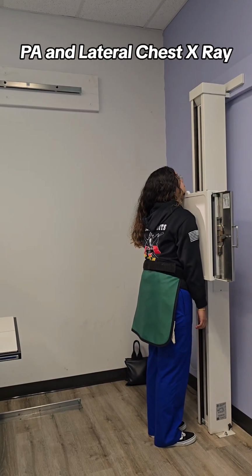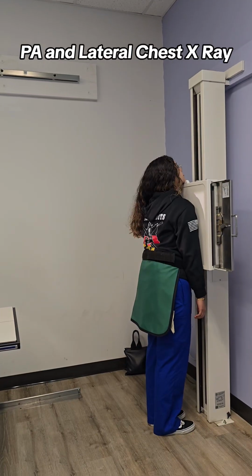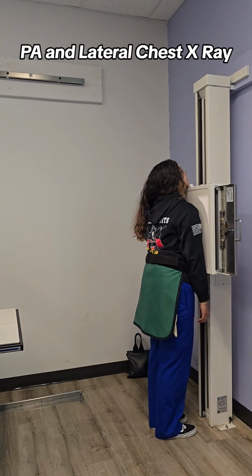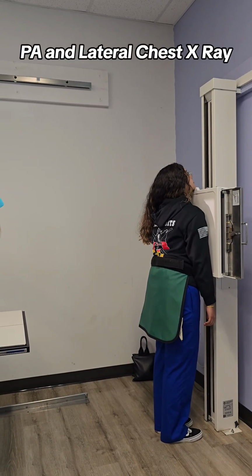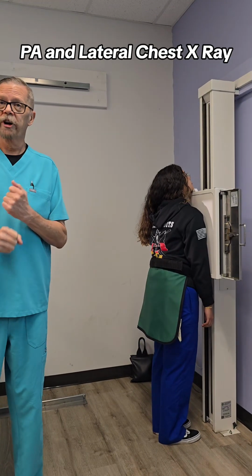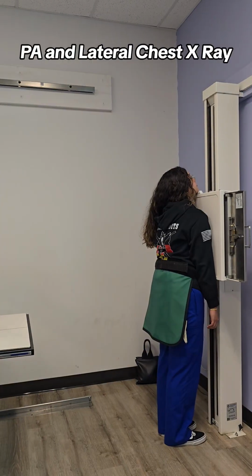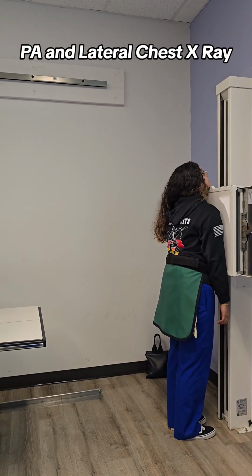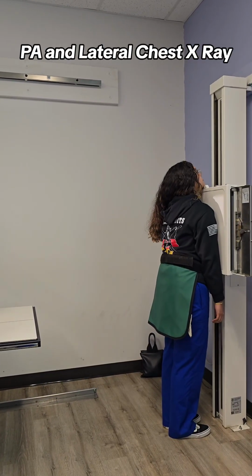Up and down collimation, top to bottom, no more than 17 inches in this case, because our image receptor is set lengthwise. So 17 inches is its size, and no more than that. We don't need anything past that last rib. How many pairs of ribs do we want to see in this projection? 10 pairs of ribs is ideal. You're going to have a little bit of light above the shoulders, that way when they breathe in, if the shoulders rise up, we don't clip anything.